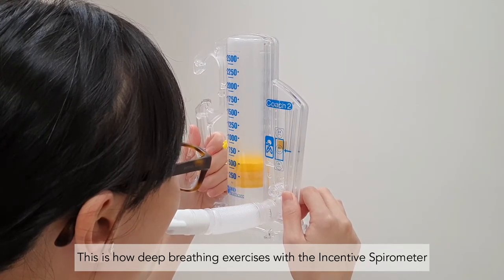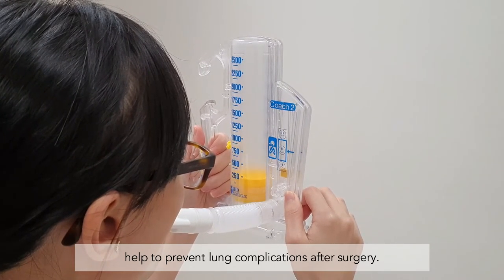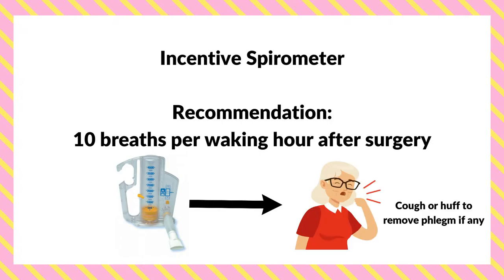This is how deep breathing exercises with the incentive spirometer help to prevent lung complications after surgery. We recommend that you do these deep breathing exercises 10 times every hour, followed by a cough or huff to clear your phlegm if there is any.